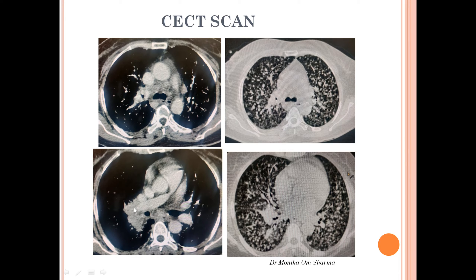We can also see increased density in the right perihilar region just abutting the main pulmonary artery — this was a right perihilar consolidation. There was no pleural effusion even on CECT chest. On the lung window, we can see multiple nodules of size two to three millimeters uniformly and randomly distributed, and again that density in the right perihilar region is seen here as well.